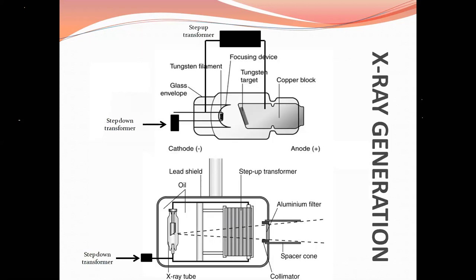Let's go ahead to how the X-ray beam is generated. Like I said earlier, this is your glass tube. So we'll first focus on this portion.